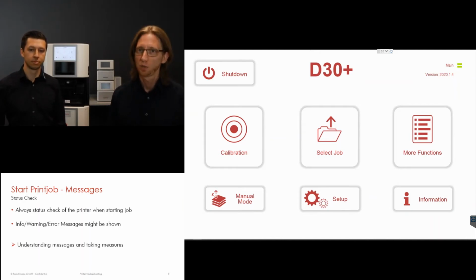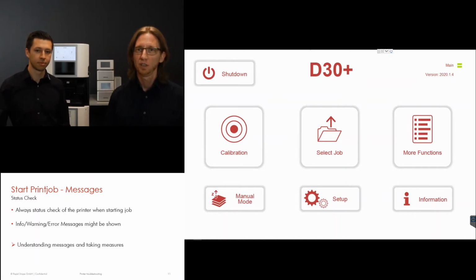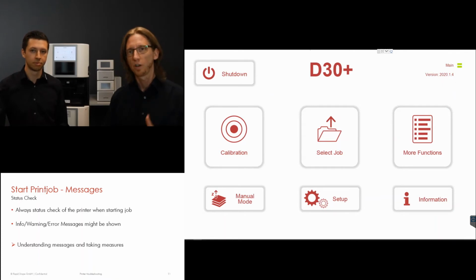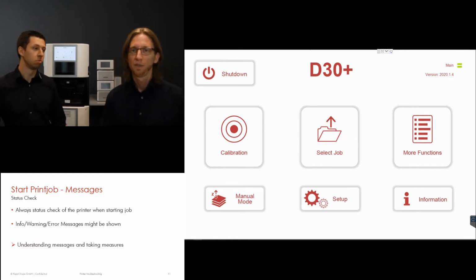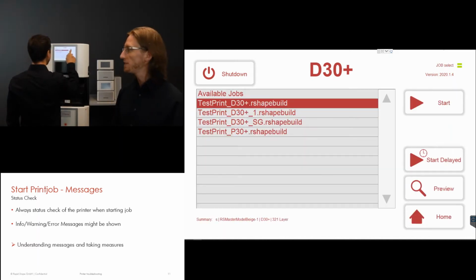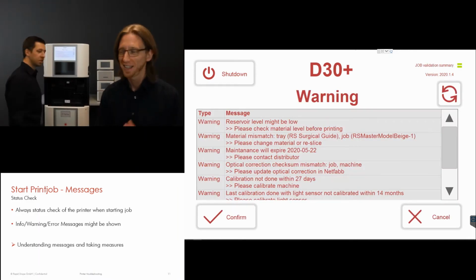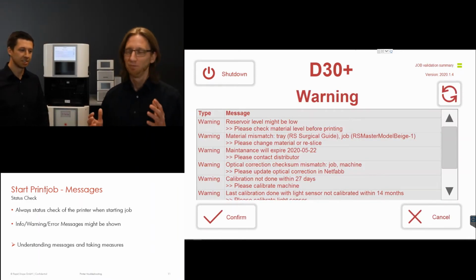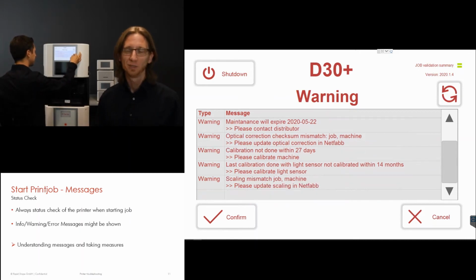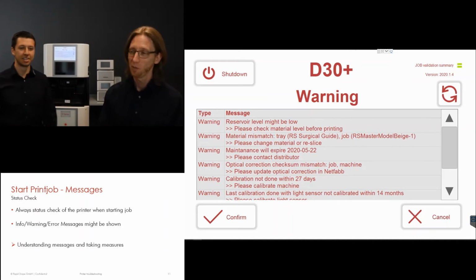I'm quite sure that all of you who have worked with the machine have discovered that the machine is doing some background checks when you select a certain job and you want to start this job to print. So lots of messages will appear, and we just want to show you what's actually going on. So Robin, can you please start one of our prepared jobs? And as you can see, this is the worst possible situation you can get. We did some preparation on this machine and on this job, obviously.